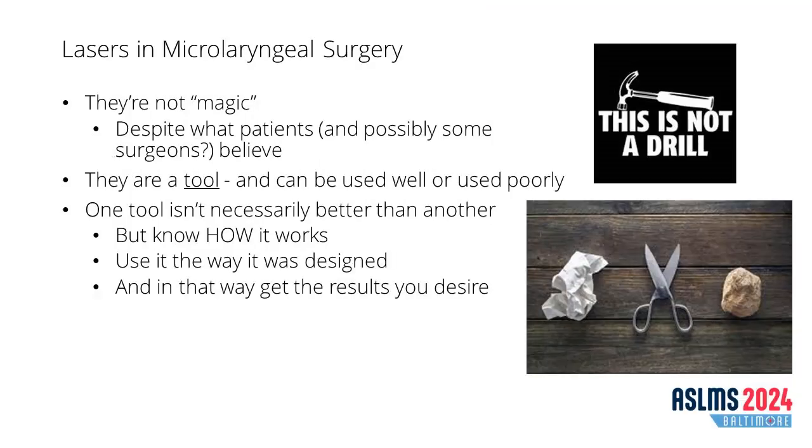So with that overall approach in mind, why do we use lasers? I like to tell my patients lasers are just a tool. There's nothing magic about a laser in the larynx. There's a lot of, I think, PR around lasers. I think a lot of patients want to know if you're going to use a laser. They get very excited when you say you're going to use a laser. But just like any other tool, they can be used well or they can be used poorly. And one tool isn't necessarily better than another. So with that cyst example, I wouldn't, in my own practice, have had a role for a laser. To me, that's a cold instrument case. But there are certainly times where we do use lasers, and we're going to talk about that.